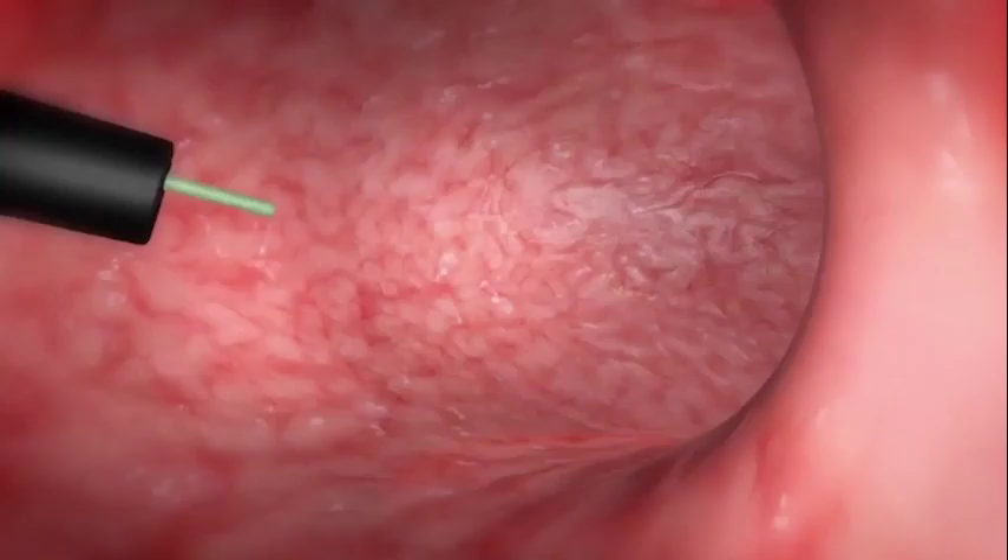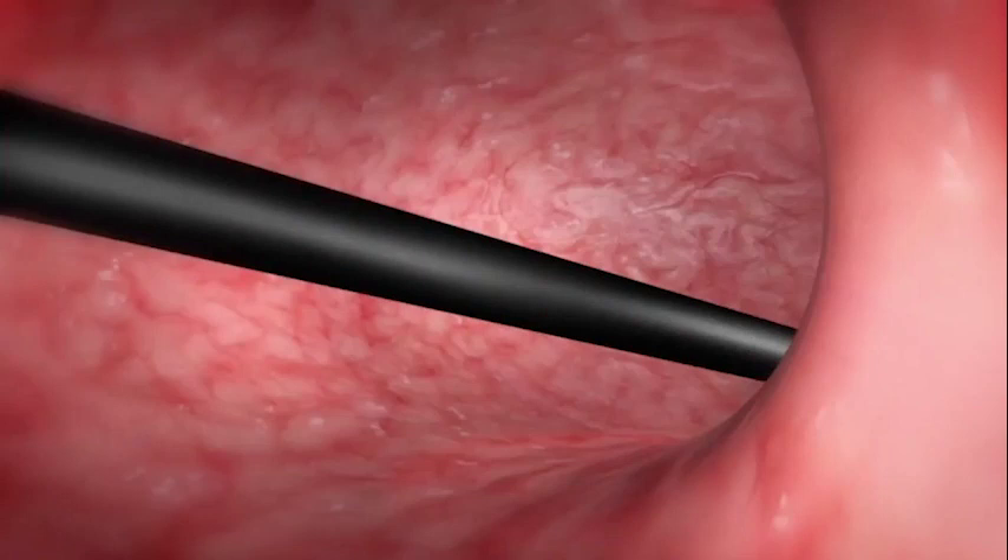It's not a surgical procedure. Instead of using anything to cut or staple, we put an endoscope inside the mouth and take sutures in the form of a purse-string suture in different patterns, creating a tube.